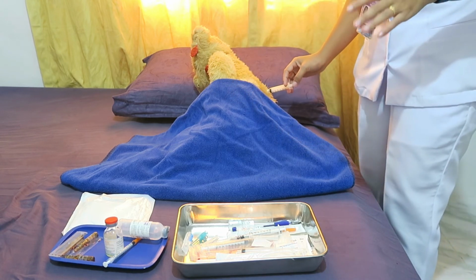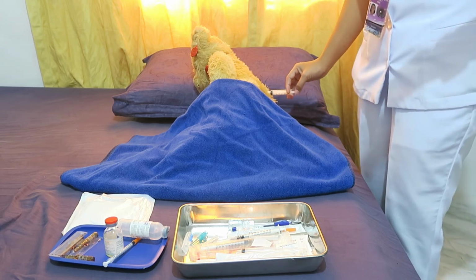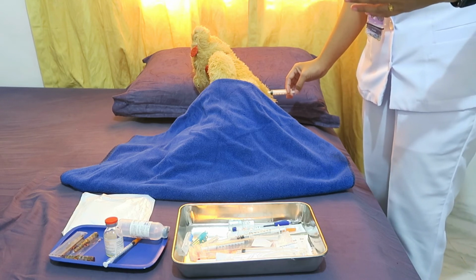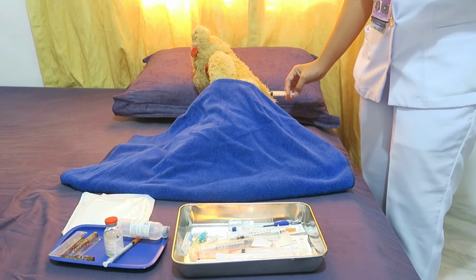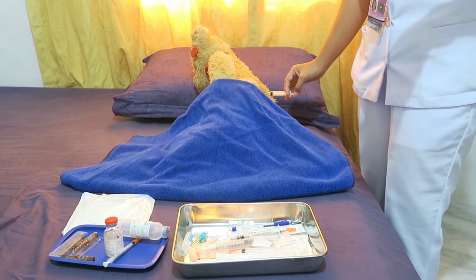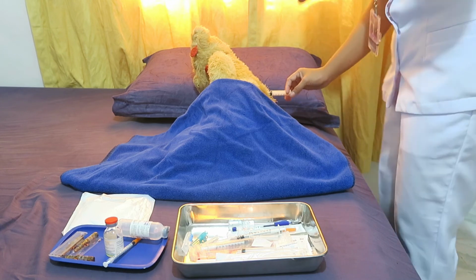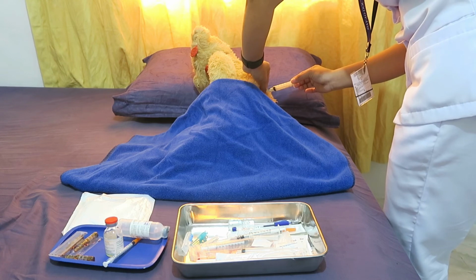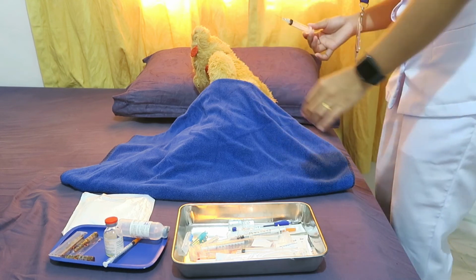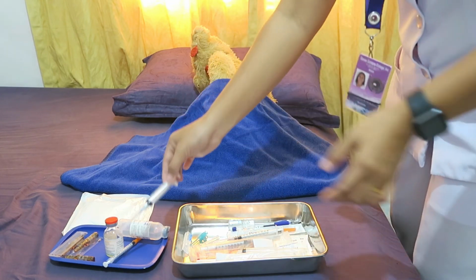So, after injection, wait 10 seconds if using the ventrogluteal site. The rationale for that is that waiting permits the medication to disperse into the muscle tissue and also decreases patient discomfort. And after that, withdraw the needle. The rationale for that is to withdraw the needle smoothly at the same angle. So let's remove the needle. Okay, then cover it. Then after that, discard.